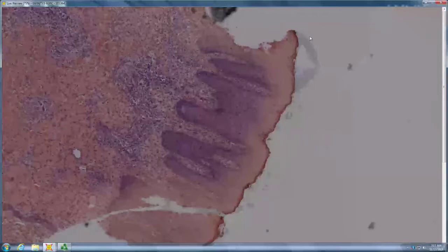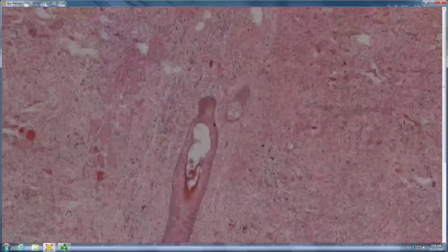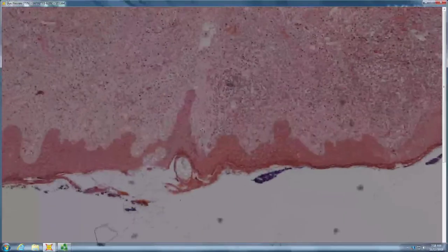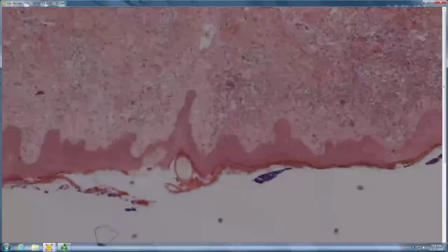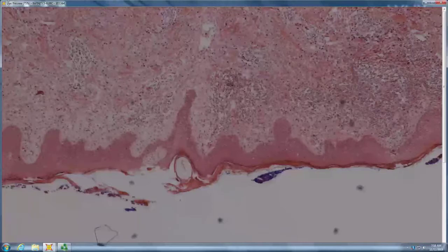So you're definitely going to want to walk your way through this, see how they mark. Tread carefully. Okay. So the gamma delta is bad prognosis. And gamma deltas tend not to have a good prognosis. That is true. And the subcutaneous panniculitis-like T-cell lymphoma is certainly much better. Is gamma delta B or T, or is it only T? Gamma delta is T, and the subcutaneous panniculitis-like T-cell lymphoma is obviously T. Okay. But there are sub-Q B lymphomas as well.